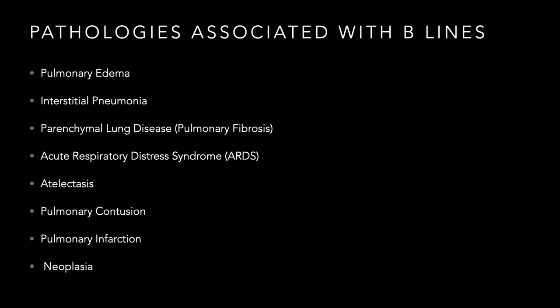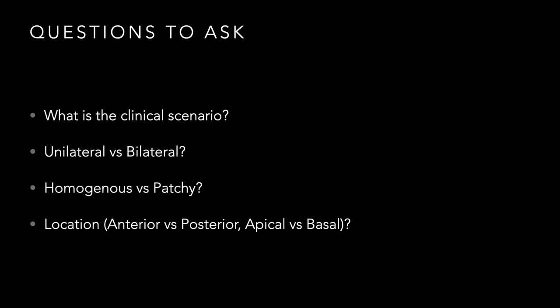So then what we need to do as providers is start asking ourselves certain questions, and that is, what is the clinical scenario, right? And that's where it starts. Like, what does this patient present with? If they present with cough and a fever versus I just got hit by a semi truck, those are two very different clinical scenarios, and it's going to lead us down a certain path, right? You're not going to say if you got hit by a semi truck and you have B-lines that it's COVID, right? Maybe it could be, but it's probably going to be their pulmonary contusion, versus I have cough and a fever and it's 2020. I'm kind of leaning towards that COVID side. And since they don't have a history of getting hit by a semi truck, I think we can rule out pulmonary contusion on this one, right? That's kind of how we're going to start with that. So what's the clinical scenario?